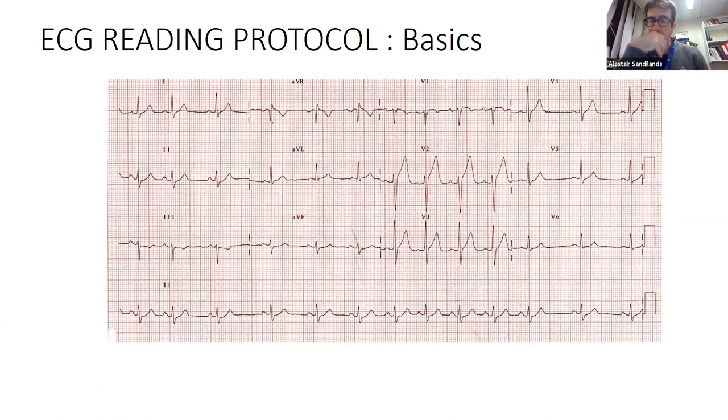Have a quick look at this one. Okay, so someone's put something in the chat. There are two alternative methods of calculating heart rate. How do you know when to use either one if they give two different answers?